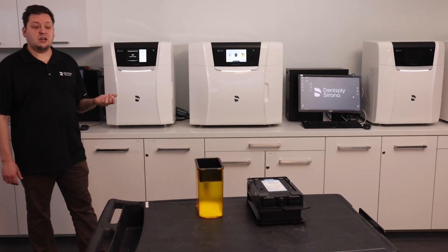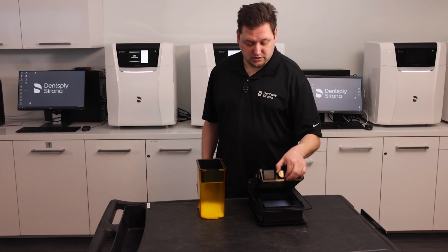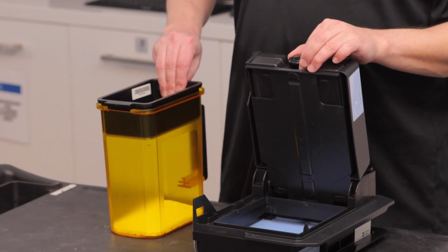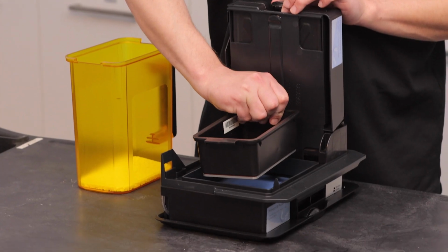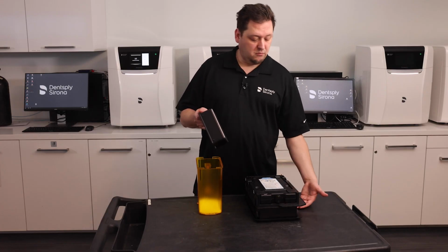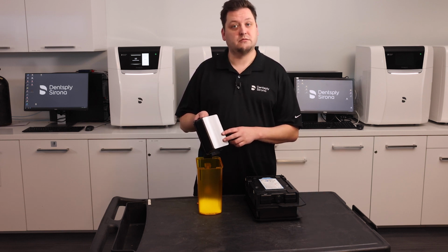So what's happening inside the printer? Right now, it's lifting up the cartridge and dispensing the requested amount of resin. It's also going to be lifting up the build plate with a robot arm and dropping it into the resin bath. It's going to begin heating the resin from below, from the metal plate that's inside the material unit, and using the build plate itself.